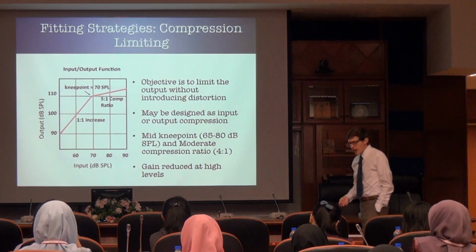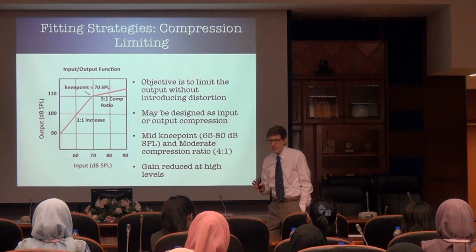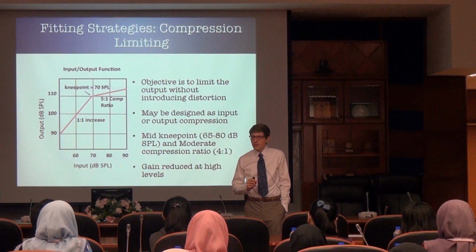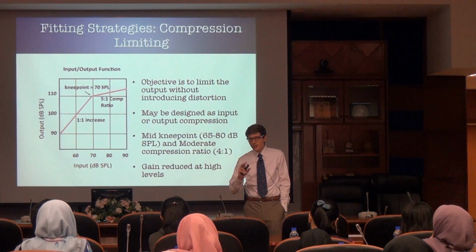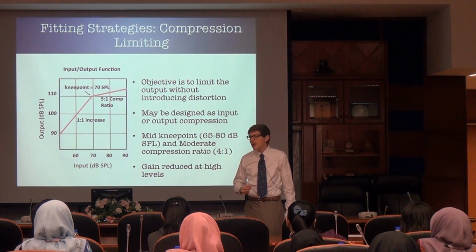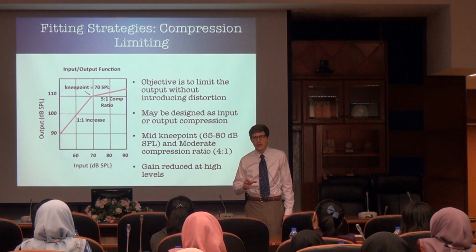Now the nice thing about that is that linear amplification doesn't have compression. And remember, compression is distortion. Distortion sounds like a really bad word, but compression is distortion. It's just good distortion, right?